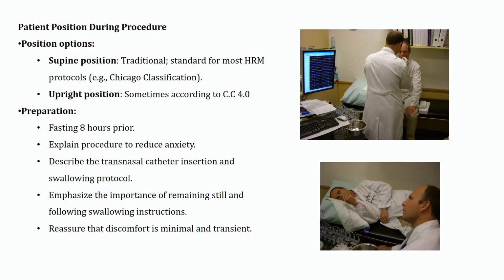And again, the most difficult part for the patient is once the catheter passes through the pharynx. Once it's past this area, everything will be easy. I mean, drinking water with the catheter inserted is very normal. There is no pain. Most patients ask how they will drink water with the catheter in. You always assure the patient: don't worry, once the catheter is in the right position reaching the stomach, everything will be okay. This is the main point.